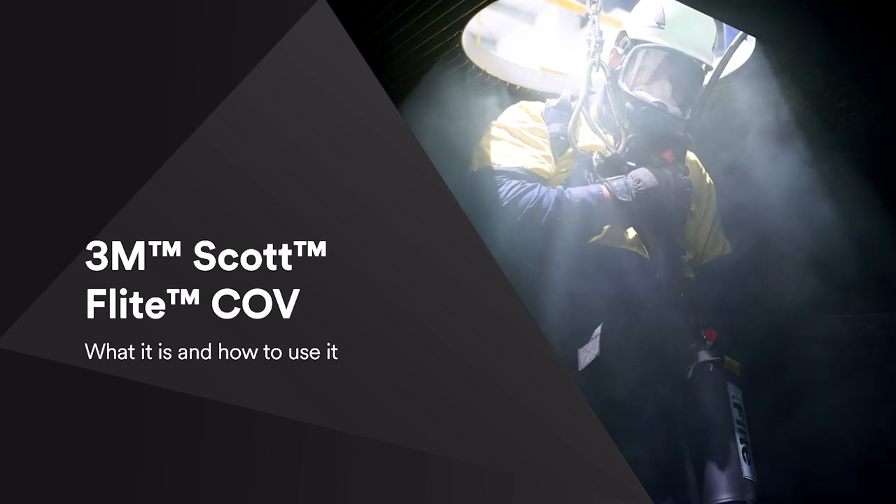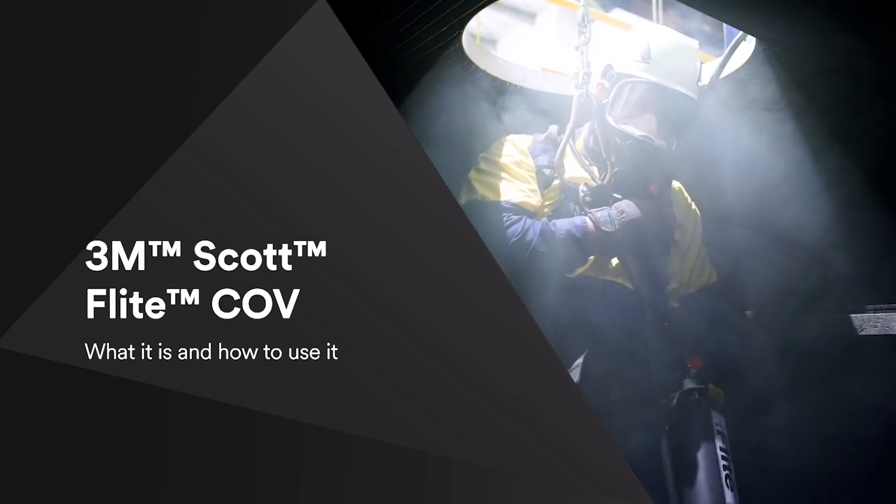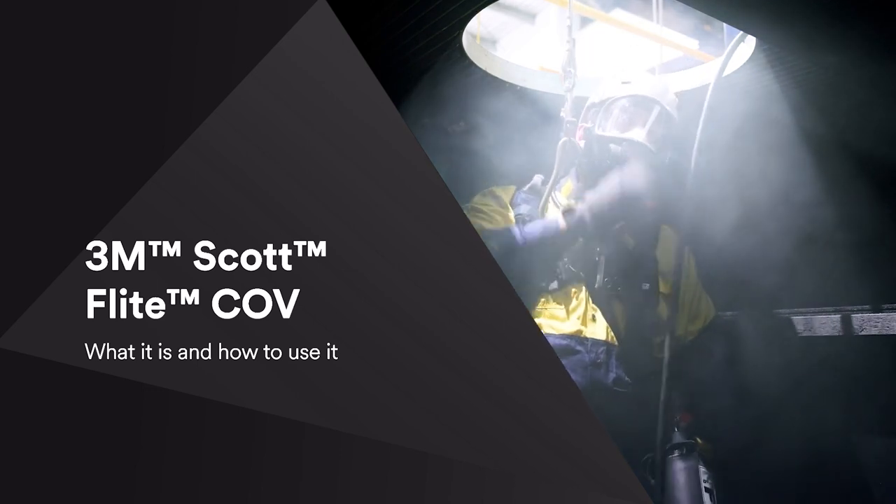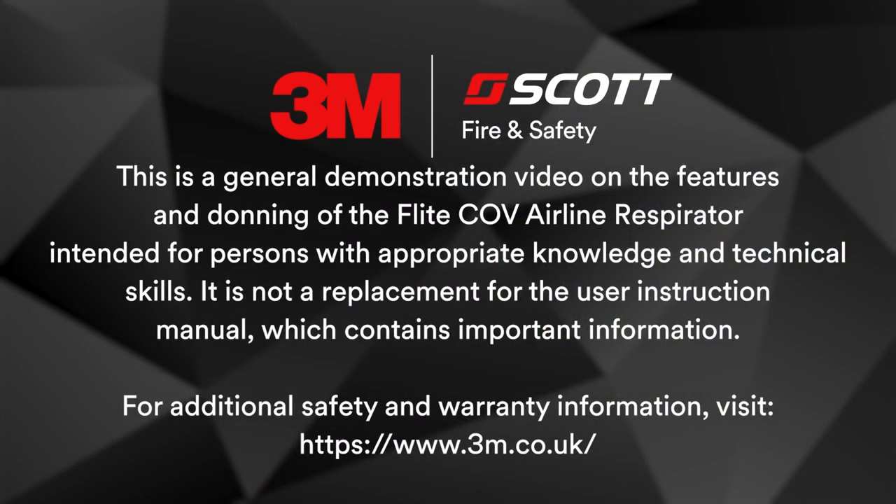This is a general demonstration video on the features and donning of the Flite COV Airline Respirator. It is intended for persons with appropriate knowledge and technical skills. It is not a replacement for the User Instruction Manual, which contains important additional information.